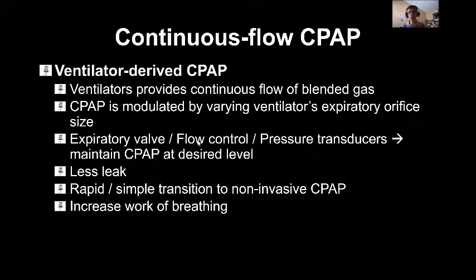It provides you also with higher pressure when you get more flow, so you can control the flow of the ventilator and give you more pressure. And also the pressure transducer, we're switching between pressures. That transducer can also help you with the pressure. These three ways can control and provide you the desirable level of CPAP. How many centimeters of water?